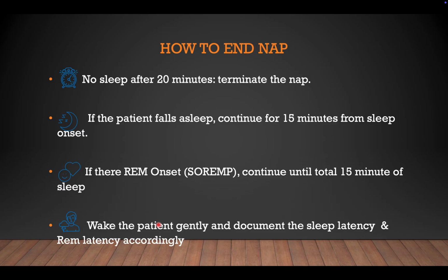Now you start the first MSLT nap within 1.5 to 3 hours, and you start scoring the sleep stages as discussed above, that is, sleep onset and REM onset. Now the question is where you will end the first nap.